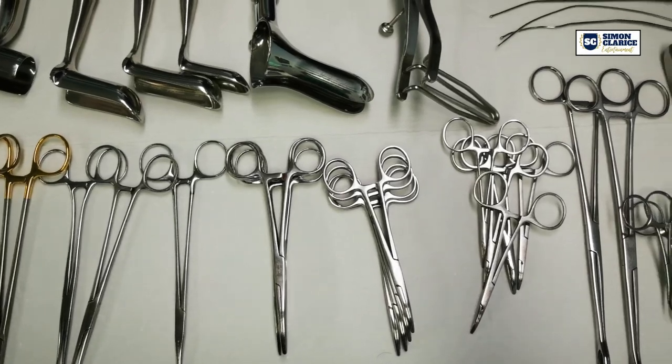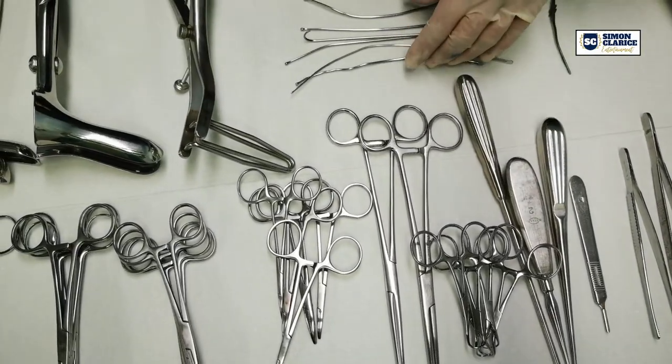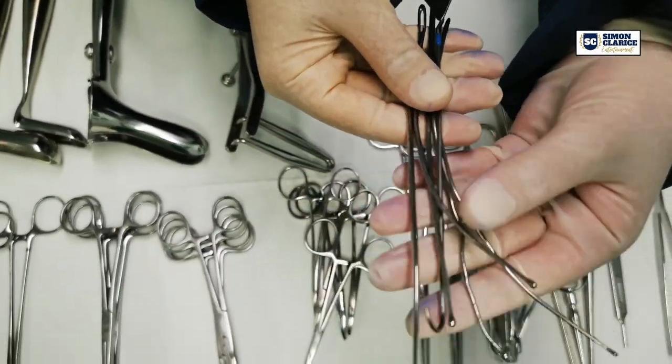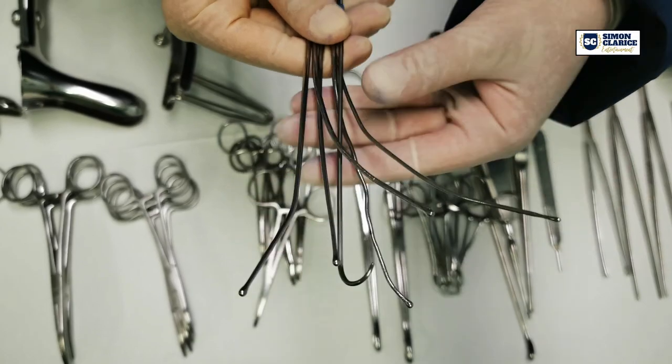In this set, there is one lacrimal probe. Six pieces of fistula probes of different thicknesses. This depends on the size of the fistula the patient has.